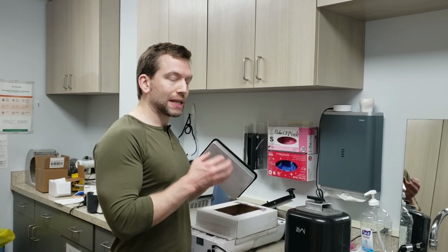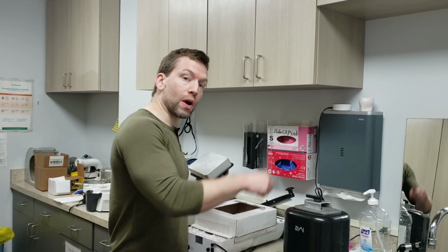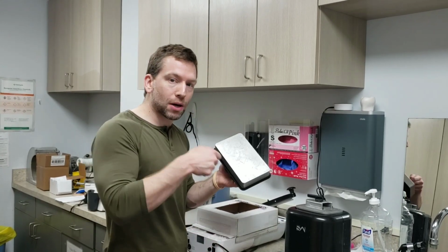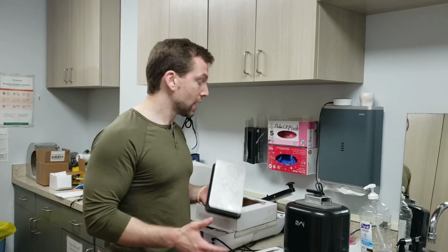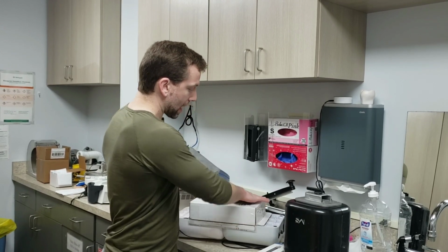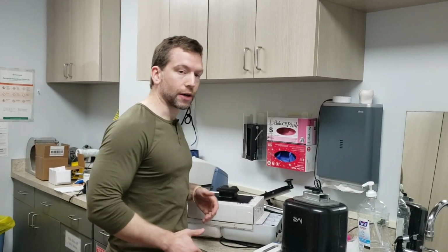It keeps things from potentially distorting when you remove them, but it also makes less work, because if I remove every object, I have to put each one in the curing unit. So I like having one mill to cure on the end. At the end, they're so hard and rigid, they pop off easier too because they don't flex as much. Personal preference, you don't have to do it. But if you're wondering how I do it, this is how, very simple. Two lights, tape them together, have a box taped on top with a hole that I just took the measurements and drew and put on there.